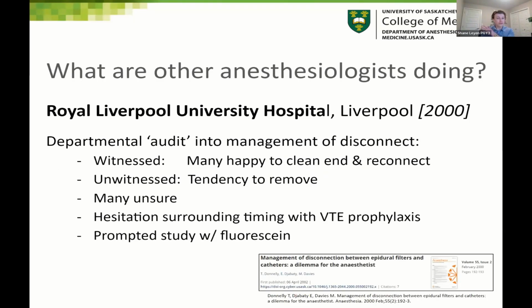So a lot of these are just surveys from around the world. This one's out of Liverpool, 2000. They did a departmental audit into the management of disconnections. Many people are happy to clean the end and just simply reconnect if it was witnessed. If it was unwitnessed, the tendency would be to remove the catheter. Many respondents were unsure, and I don't have actual percentages from this article. A lot of hesitation surrounding the timing of VTE prophylaxis, and this survey or audit is what prompted the study with fluorescein we previously discussed.